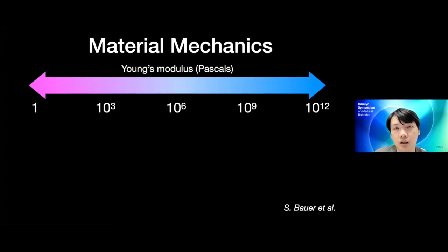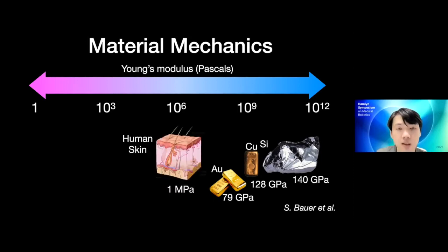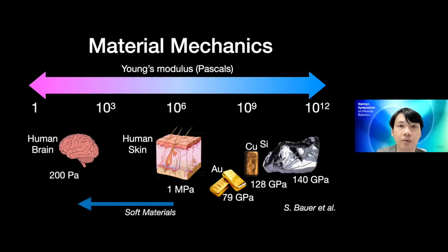So one of the biggest challenges, I think, working with the human body is that we actually have a very left end of the spectrum, right? Whereas all the materials that we are used to perform intelligent functions are right at the stiff end of the spectrum, right? If you look at Young's modulus, which is a way to measure how stiff something is, silicon technology is the workhorse, again, but it's gigapascals, hundreds of gigapascals. Metals, they're all hundreds of gigapascals, but they work very well, right? But if you look at skin and other soft tissues like the human brain, for example, if you perform brain surgery, all these things are extremely soft. They are almost like jelly that you eat, and they're only hundreds of pascals to megapascals.